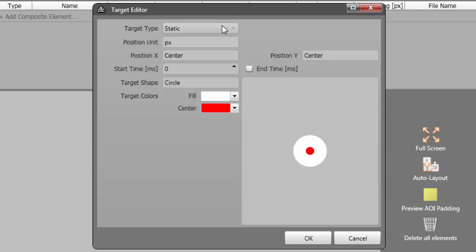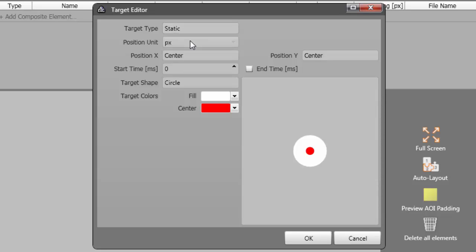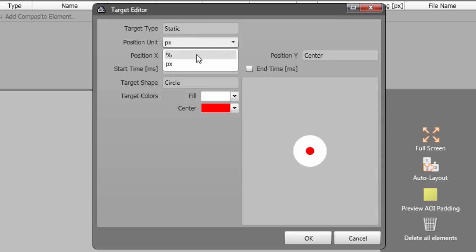First is the type of target. For our saccade task, we'll define two targets, both of type static. The position unit can either be in relative percentage or static pixels. In this experiment, I'm going to use percent. Now, let's position the first target by specifying the X and Y positions. Here, I can choose Center for both.